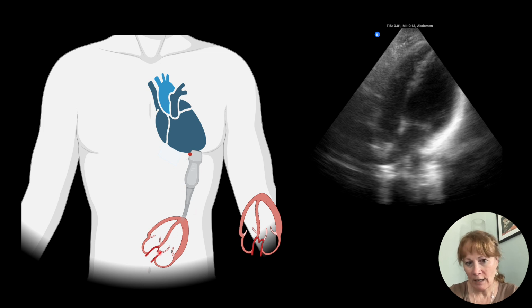So that would give you that angle. So to correct that, what you're going to do is take the tail and swing laterally. That repositions the probe so that the scan head is right at the apex. So it's just a lateral move by swinging the tail and letting the scan head move laterally right to the PMI, or the apex of the heart.